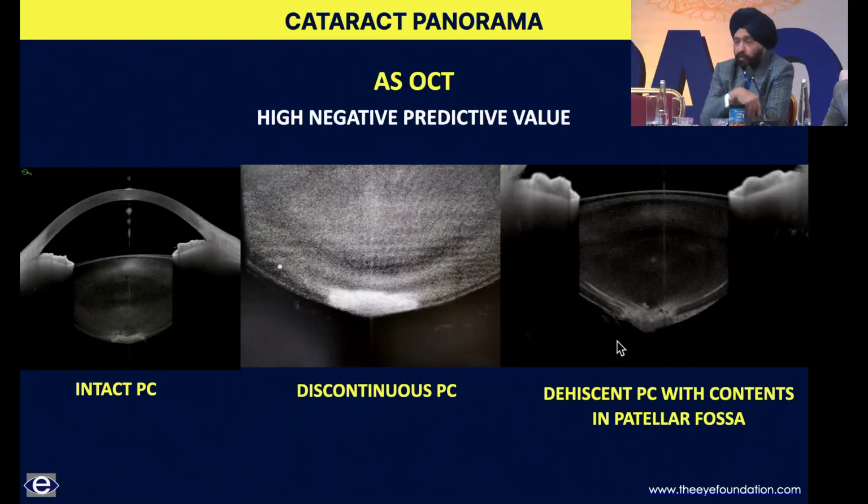This is creating an air cushion, like the airbag in your car. If you meet with an accident, you just have that cushion coming in. So you have to maintain this cushion, and only then do slow motion phaco, and the epinucleus that you are trying, you don't peel it towards the center till the end, because once you come towards the center, it's going to give way.